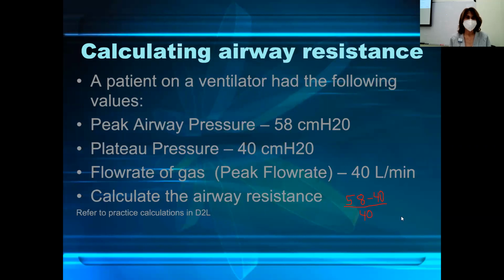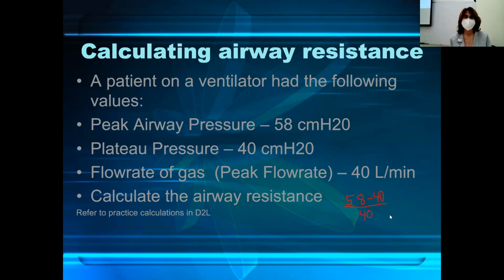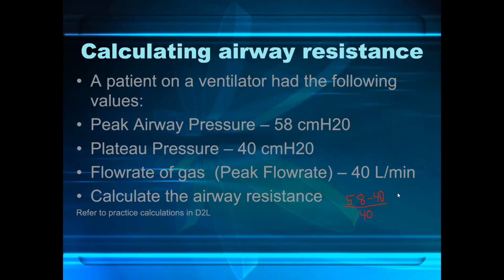Are you good so far? The peak pressure, 58 centimeters of water, is here. The plateau pressure of 40 is here. So 58 minus 40, okay. And then you divide by 40. So 18 over 40.